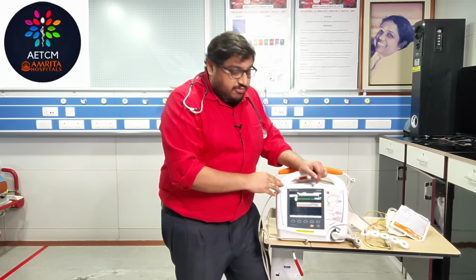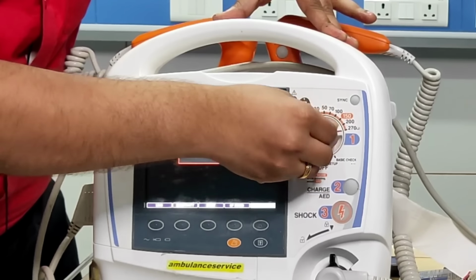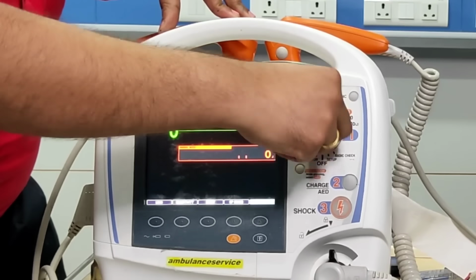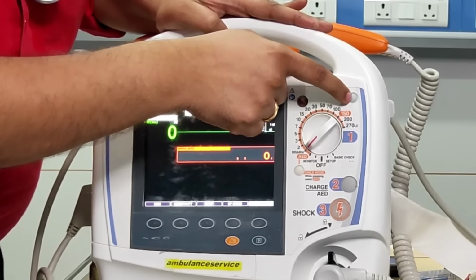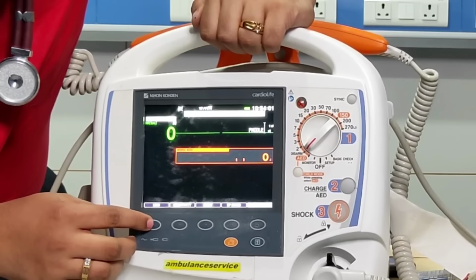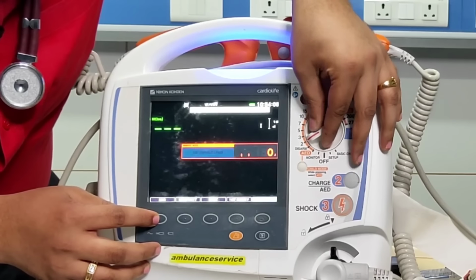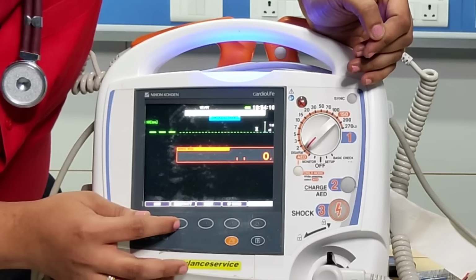So we have seen the parts of the defibrillator. I will explain it again. So this is the monitor, and you have the energy selection here, and you have the paddles. I have shown you the pediatric paddles also, and it has got an AED mode. And you see here, this is the sync button, which is for your cardioversion. This is your synchronized button. And again, there are certain other things like lead selection here. You can select different leads. Usually we will go for lead 2 here. So lead 1, lead 2, that is what we need to select.